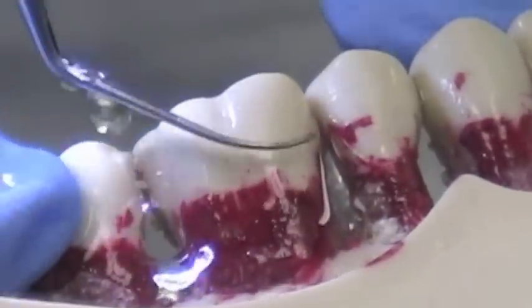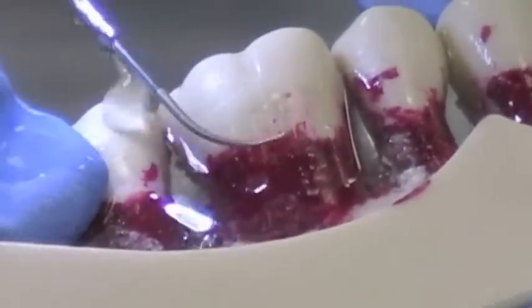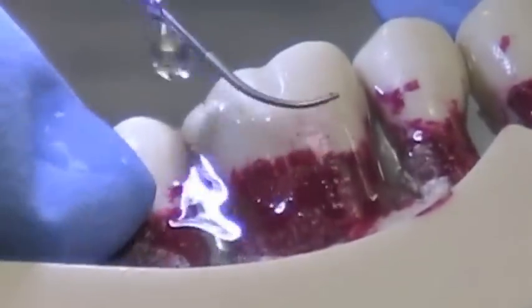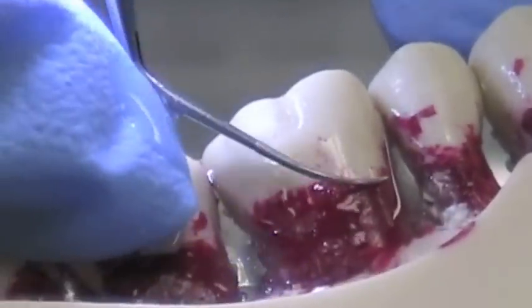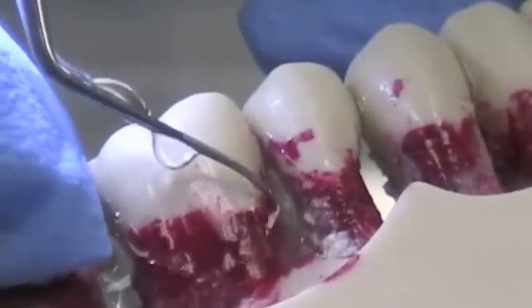Even when you're in this green range, you can go down as far as one or two instead of being up on three, which is what I prefer. And again, you can turn the water very low so that you can actually see some of the cementum coming off.